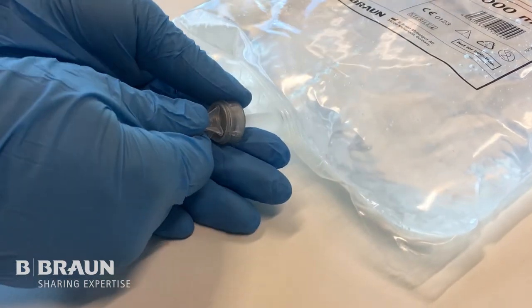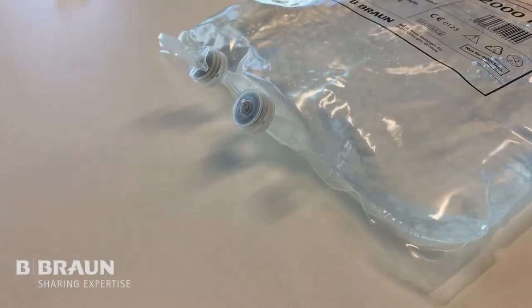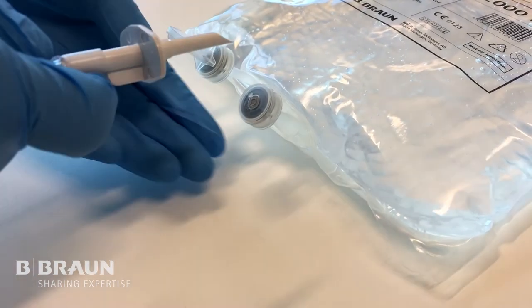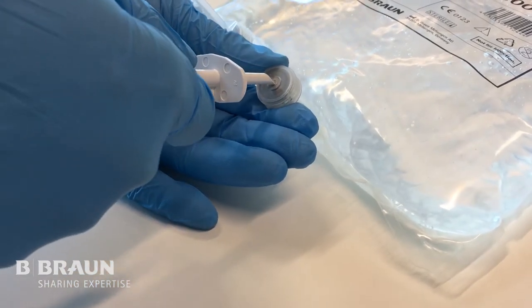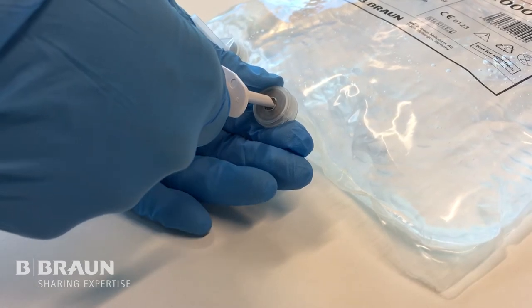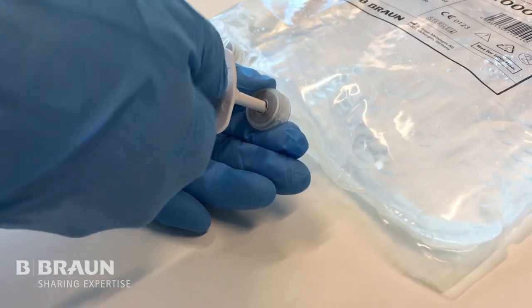Firstly, twist off the cap from the port. Introduce the spike into the centre of the port until you feel resistance. Then slightly rotate and push the spike until you feel the elastomer has been pierced.